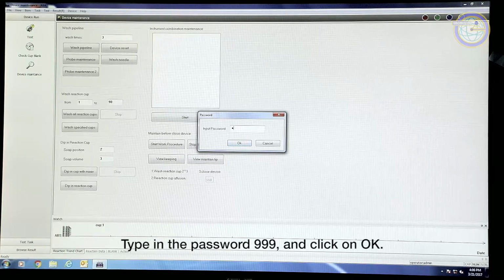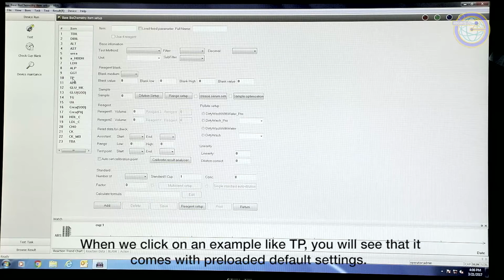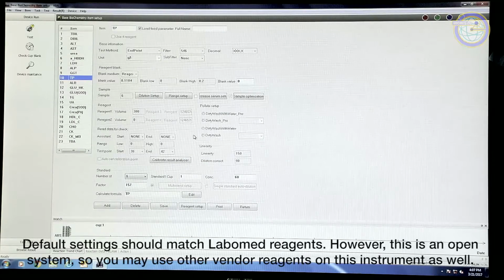Type in password 999 and click OK. Here you will see your list of different reagents. If we click on an example like TP, you will see that it comes with preloaded default settings. You will want to double check these settings with your reagent's data sheet package insert and make sure that these settings match that of your data sheet. Default settings should match Labomed reagents.